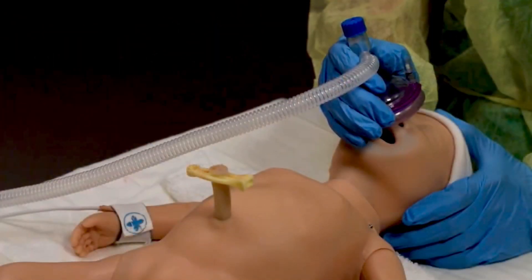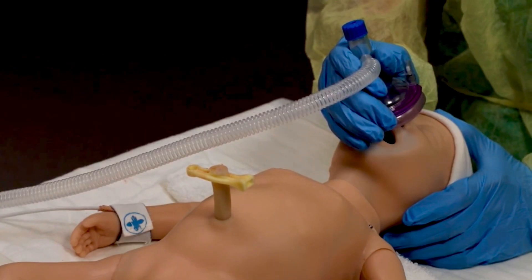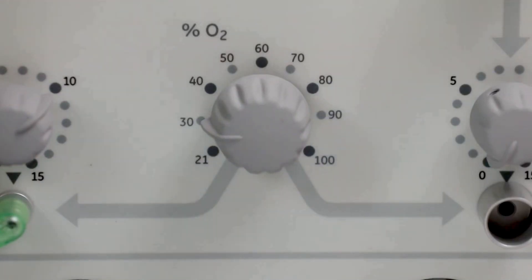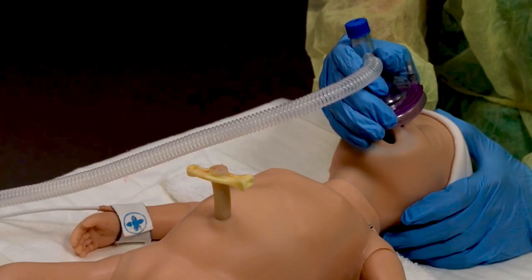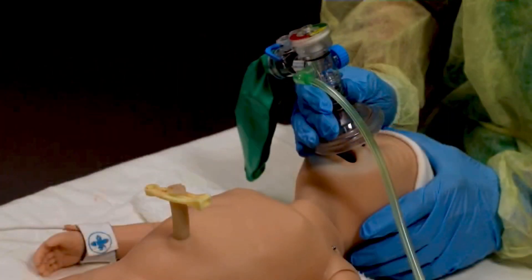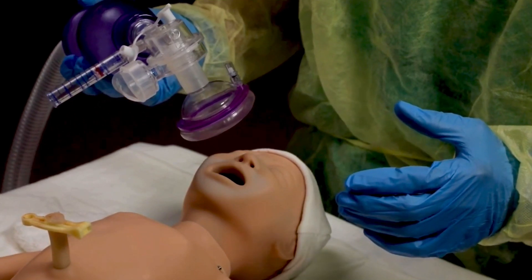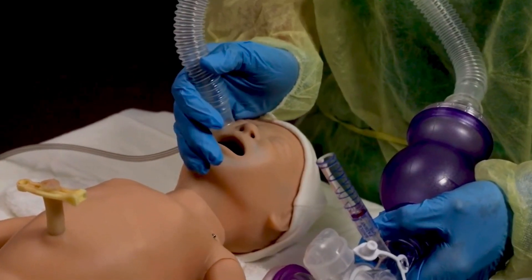Use pulse oximetry to guide oxygen management. When the baby is breathing and has a heart rate more than 100 beats per minute but below the target oxygen saturation range, begin with 30% free flow oxygen. Free flow oxygen can be given in four ways: by holding the mask of the T-piece resuscitator close to the baby's mouth and nose; by holding the mask of the flow inflating bag close to the mouth and nose; free flow oxygen cannot be delivered through the mask of a self-inflating bag, however it may be delivered through the tail of a self-inflating bag.